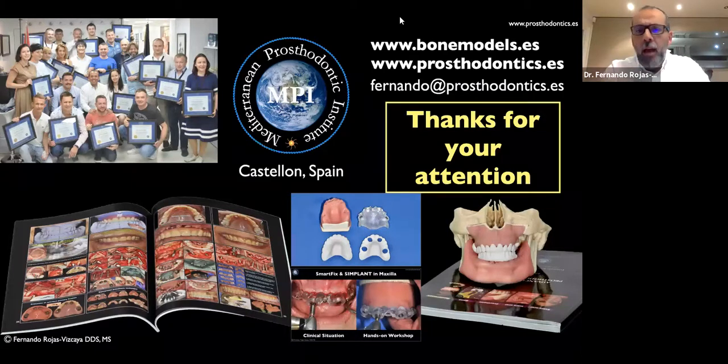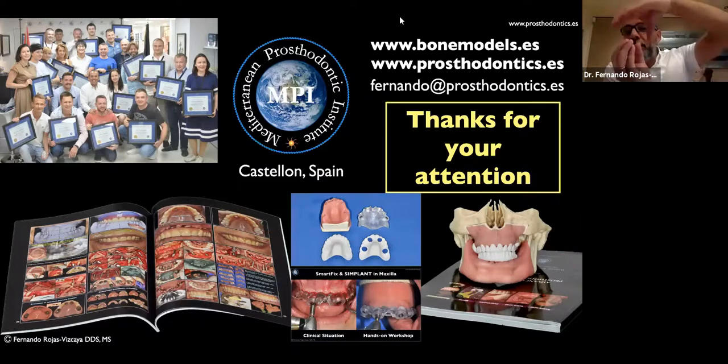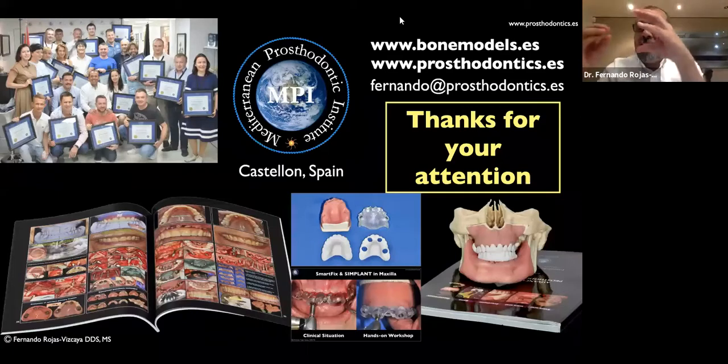So I just scan and make a bar, but make the bar with the space for the titan base. So if this is the titan base, imagine that this is the bar. So you have tolerance. When you put the titan base in the bar, and now you put in the top and you screw, every titan base is fitting 100%. And you glue the bar, and now the full bar is fitting, and now you scan again. If you can see that you cannot fit that bar, you need to section, of course, and glue again. But I never need to section this bar because probably the tolerance is okay, but I am doing this step.